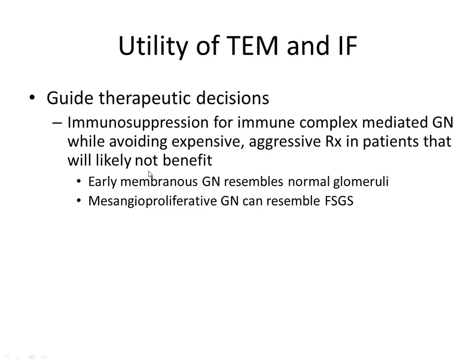The issue is that when you have very early disease, some immune complex diseases like membranous that are very early are going to look completely normal via light microscopy, to the point where they actually look like very beautiful glomeruli. And everybody's like, oh, look at how gorgeous these glomeruli are. And then I go to EM and I find immune complexes on the outside surface of the glomerular basement membrane. So if you didn't do EM, you would have said these are completely normal glomeruli. This patient doesn't have immune complex disease, and the patient wouldn't be treated appropriately.